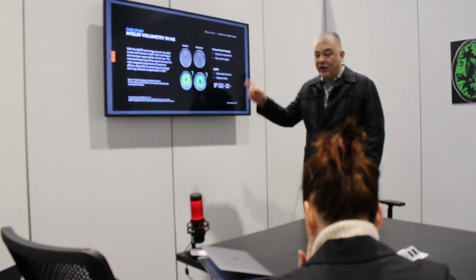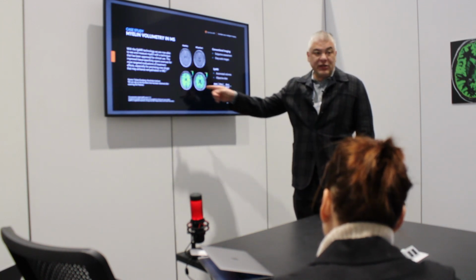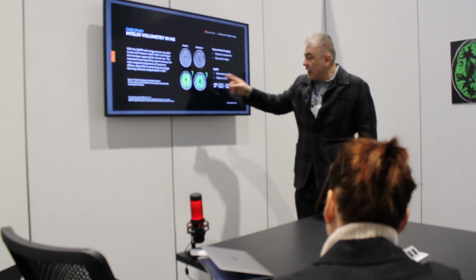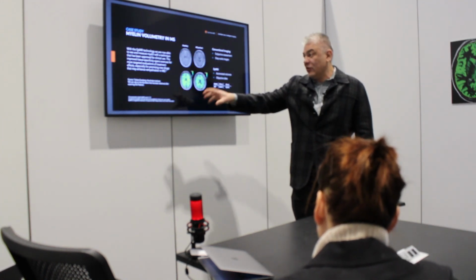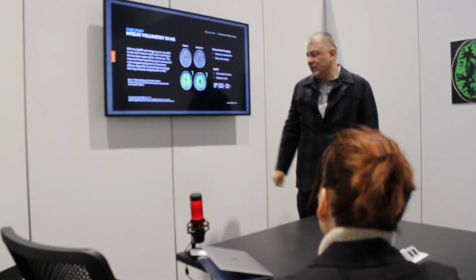Absolutely, and not only in MS. I'm going to show cases of it, but yes, and that's why I'm showing the article first, because this has been published, validated. And this is just an example from the article. I'm going to show you cases on my own, but this is from an article, so you can see that this has already been validated. This is from the Karolinska Institute.